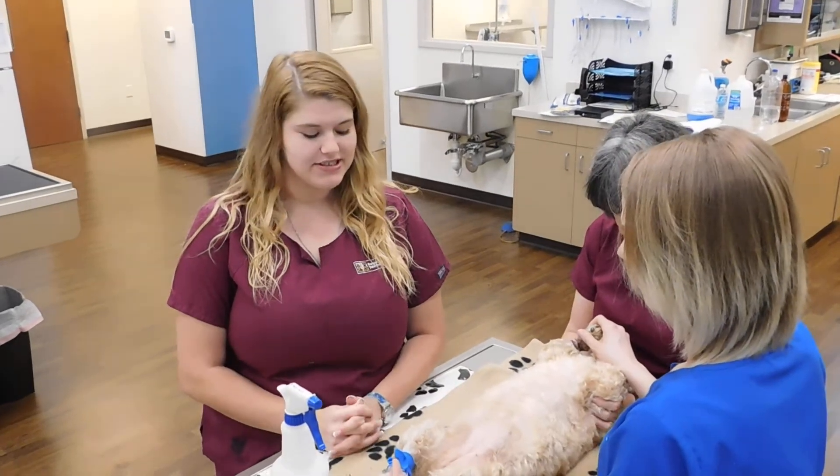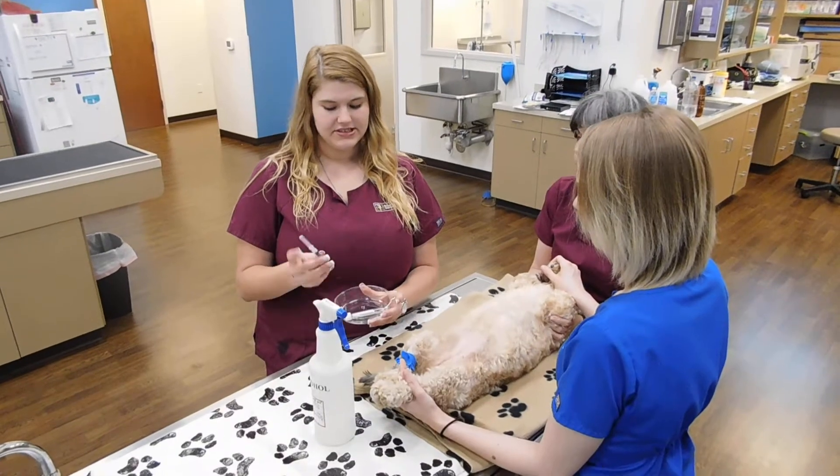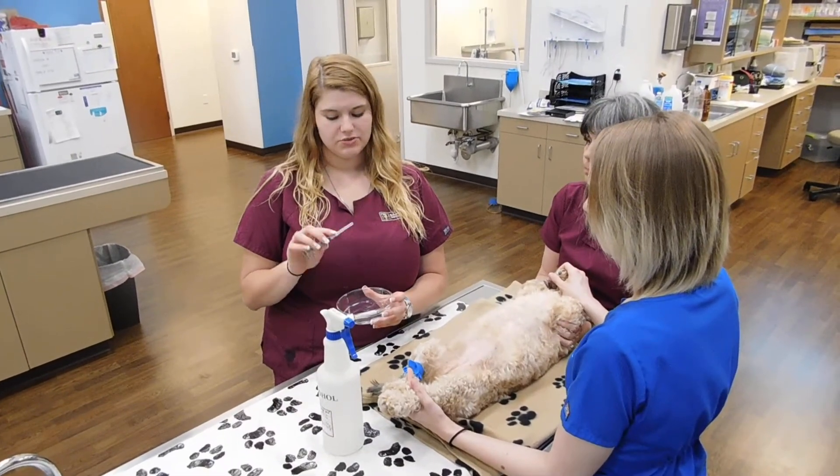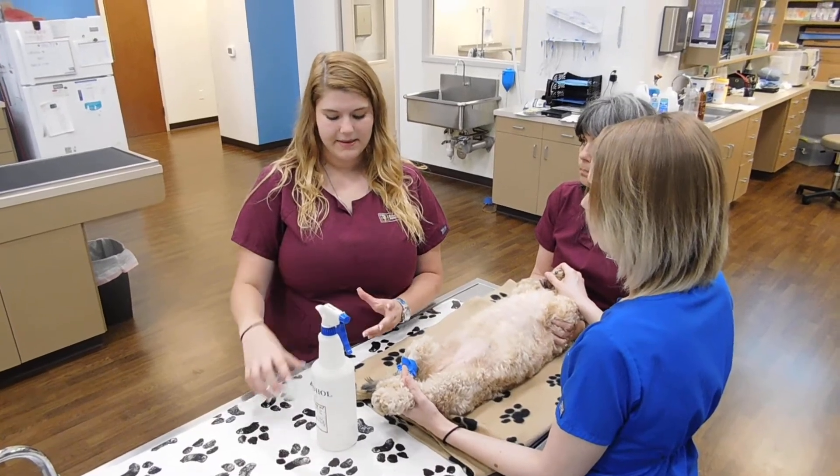This is task 24. We're going to be doing cystocentesis on a female dog. In our tray supplies, we have a 3cc syringe and a 22 gauge needle, which is one and a half inch. And then we've got our tube here with no additive to send off to the lab, and our alcohol.